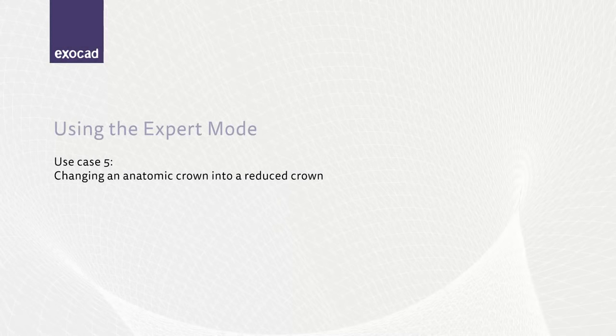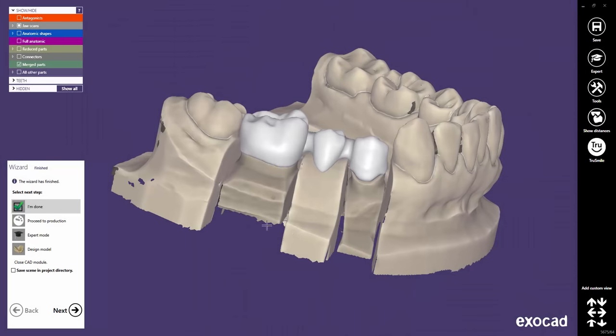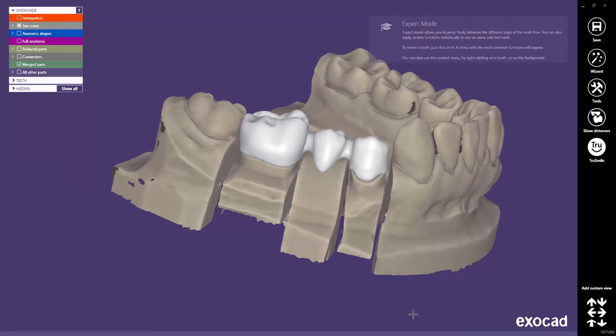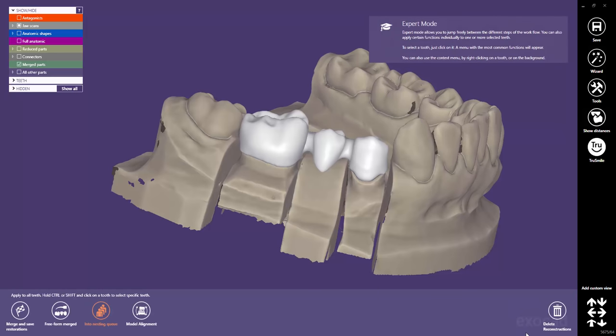In the next sample case, we will do the same as before in reverse direction. We will change a full contour crown in a finished scene into a reduced crown. Again, I have reloaded a case and switched to the expert mode. I delete the merged parts.